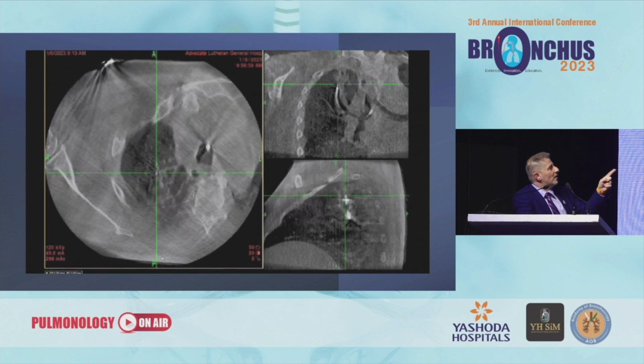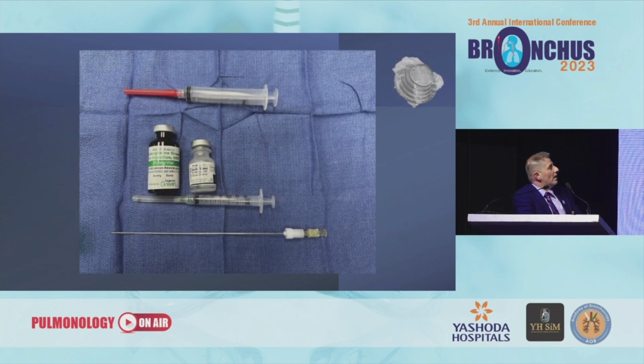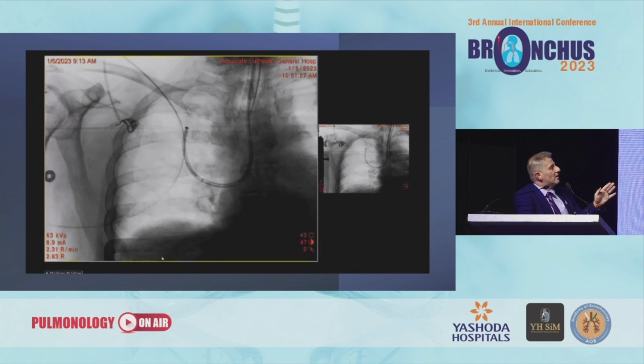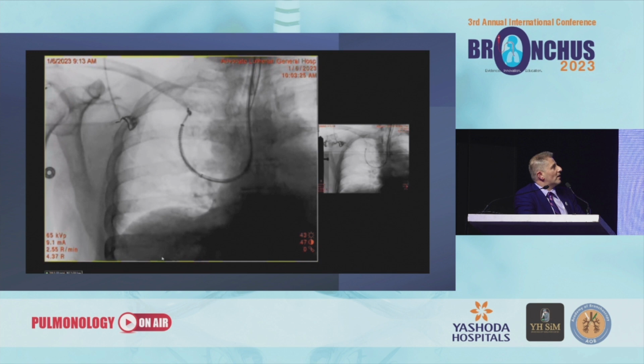And confirming the location with the tool in target, the ICG was soaked over the fiducial inside the tube, and then that fiducial coil was advanced to the area where the lesion is.